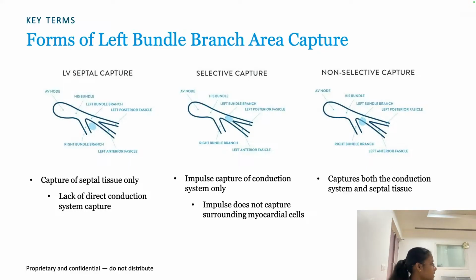We are not taking CSP into CRT. CRT is the best one, and CSP is the backup of CRT. But through the lead placement in the septal area, we can get the activation of both LV and RV, which leads to a narrow QRS. So nominally for LV it's around 60, and for RV the remaining 60 would be fine to get a 120 QRS.